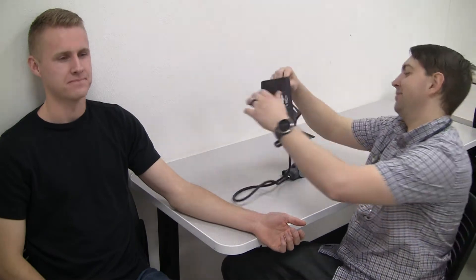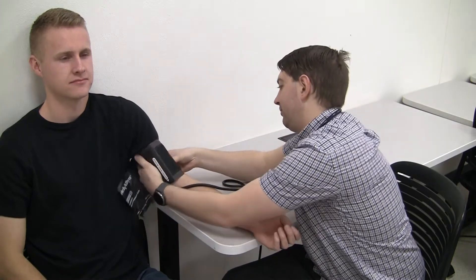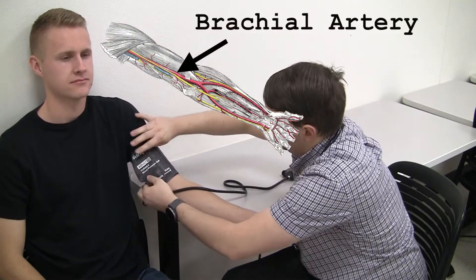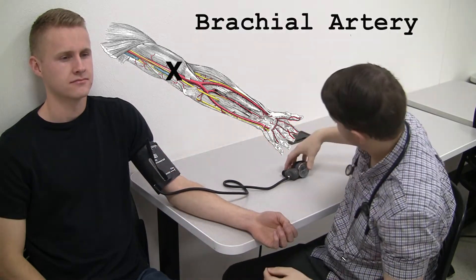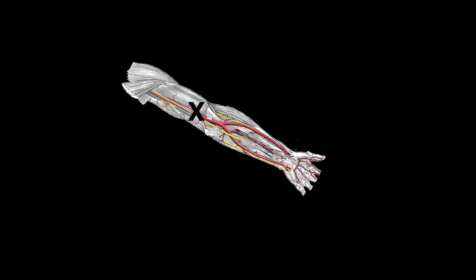The first step is to find the patient's expected systolic pressure. A sphygmomanometer, or blood pressure cuff, is placed on the patient's arm over the brachial artery. We want to find how much pressure it takes to close off the brachial artery — we're going to stop the blood from flowing through the brachial artery.